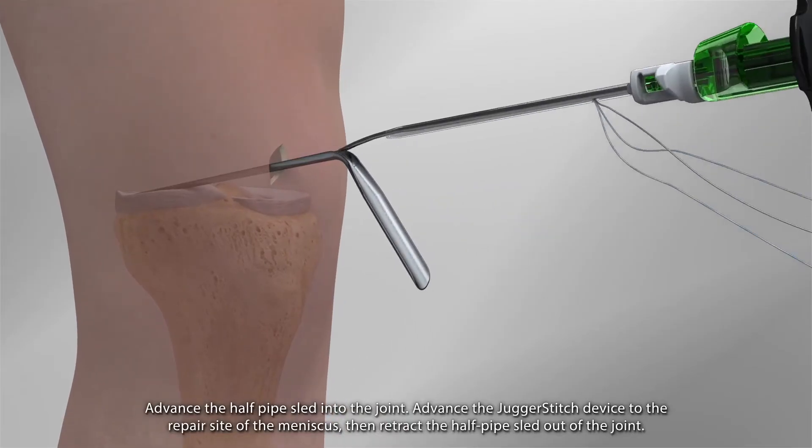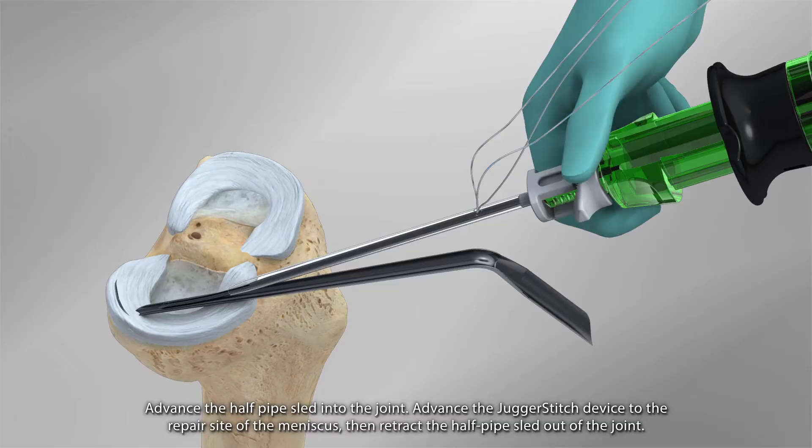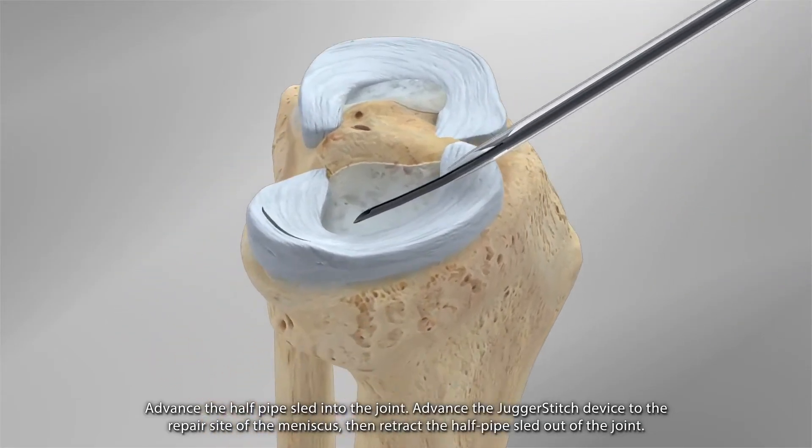Advance the halfpipe sled into the joint. Advance the JuggerStitch device to the repair site of the meniscus. Then, retract the halfpipe sled out of the joint.